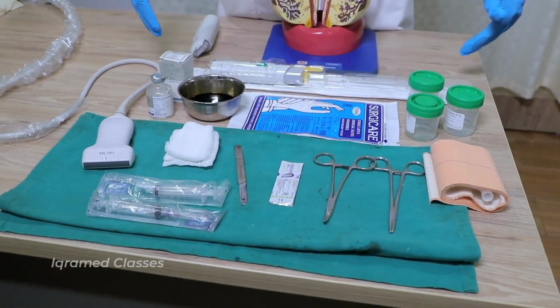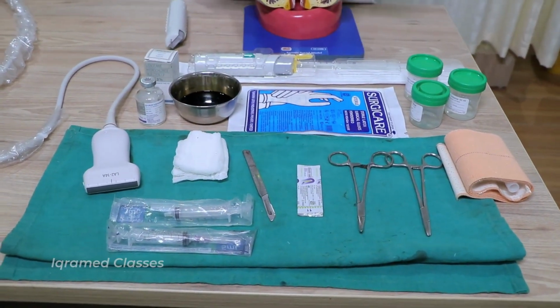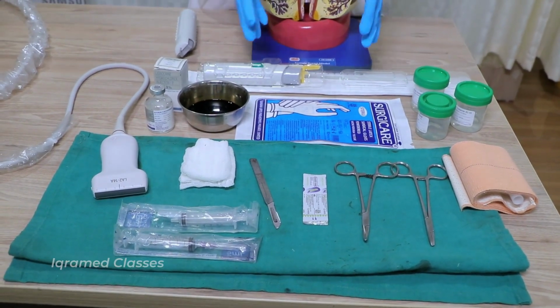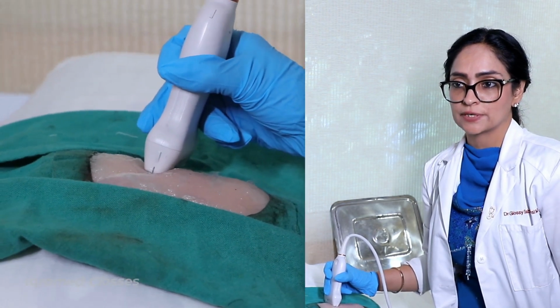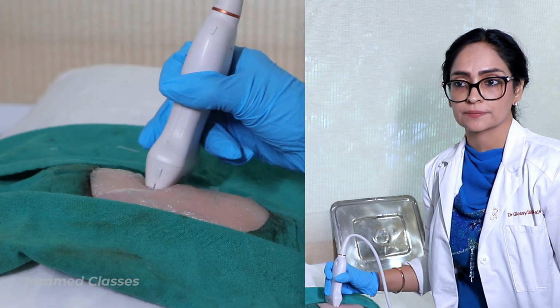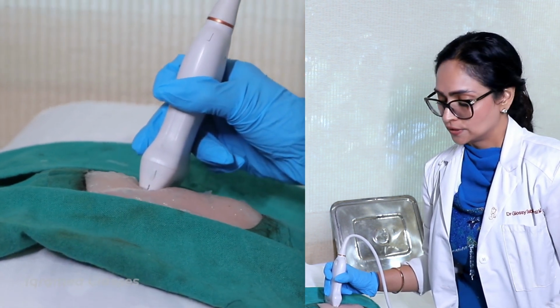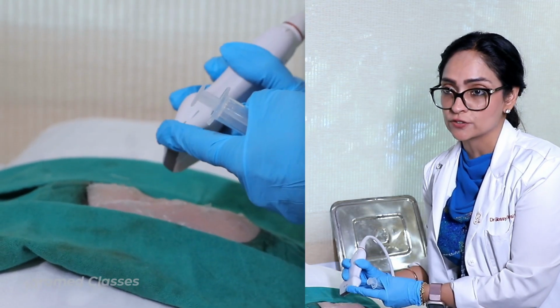Now, this is our basic setup. We will show you how to do the fine needle aspiration from a cyst and how to do ultrasound guided core biopsy. Now we are looking at the breast tissue and that shows a well-defined cystic lesion. Now, carefully look, my probe is in the transverse position and this is the right of the probe.